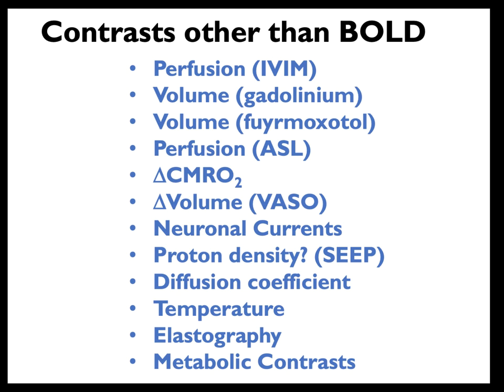But as far as brain activation imaging, bold still seems like it's the dominant technique because it's so sensitive and it's so easy to do. So those are the two main things that really cause bold to stay on top of this pile of all this other information that's very complementary. But still, the field goes for the sensitivity and the ease of use.